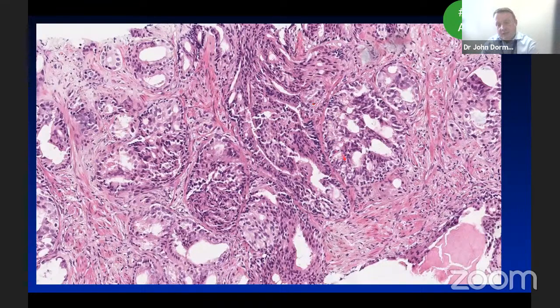You tend to get this pleomorphic area on the outside of the gland, and then towards the middle of the gland, you get this almost paradoxical differentiation. You can see some quite significant cellular atypia and nuclear pleomorphism in that gland, for example. You wonder about there being a slight bit of comedonecrosis, although I don't think that's entirely convincing.